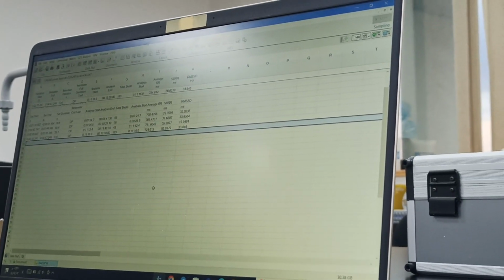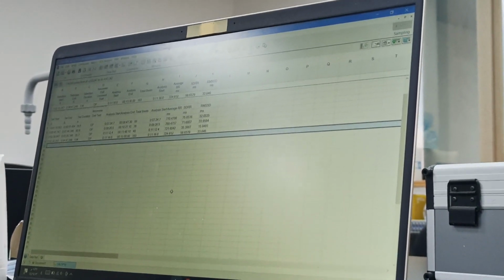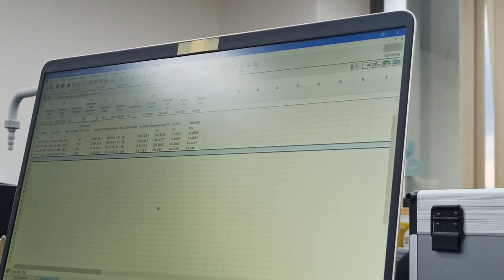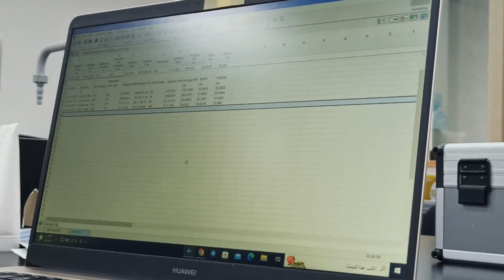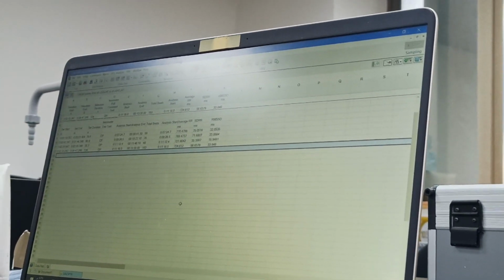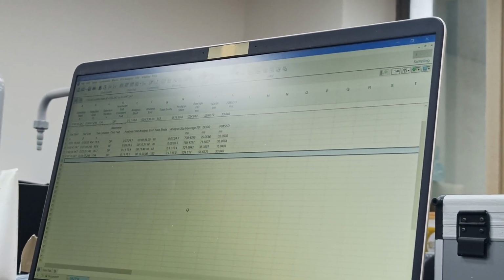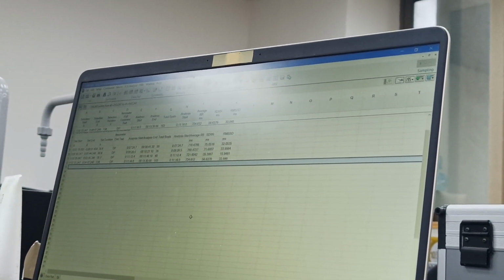How can I decide that this is the perfect interval? Perfect interval is 5 minutes in most of the cases. For example, the tilt: you have 5 minute baseline, 5 minute tilt, and 5 minute post baseline. For deep breathing, because it is a 1 minute total, pre should be 1, post should be 1. So select a 1 minute interval before deep breathing, then during deep breathing, of course, it is total 1 minute, and then after deep breathing, again 1 minute.